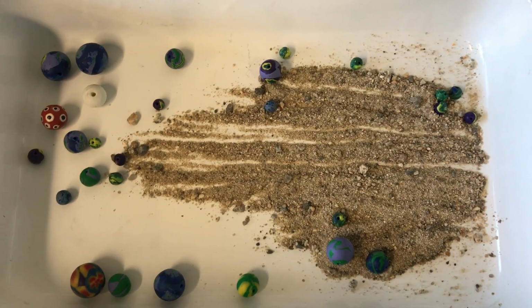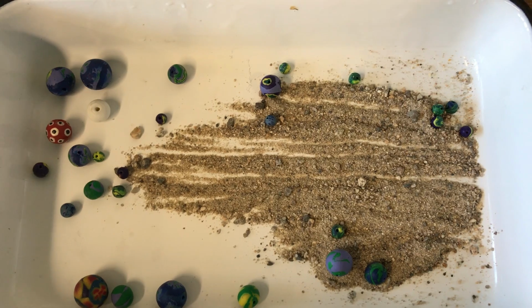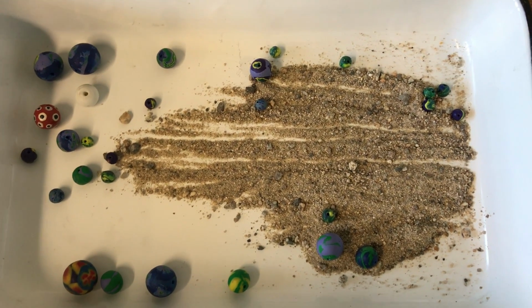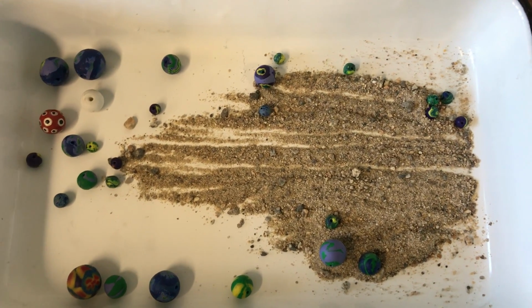And you can do more than one thing with a smear, so the feathered edge may be useful for one thing, the monolayer for another, and the body of the smear may be for another, but we have to think about where things land. And so I wanted you guys to have a bit more of a visual about what determines where things land, so we can talk about it in the context of the smear.